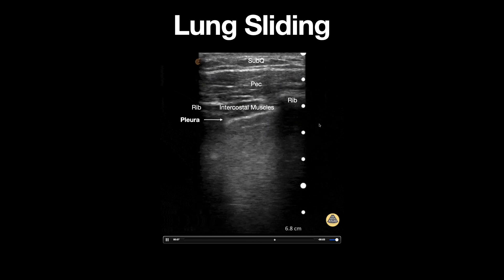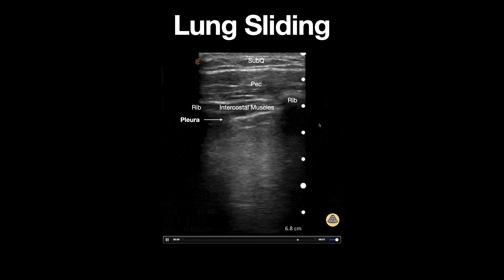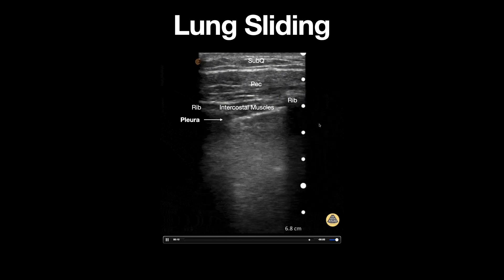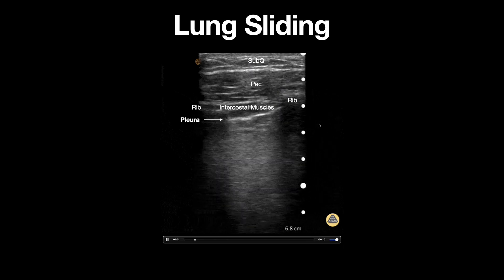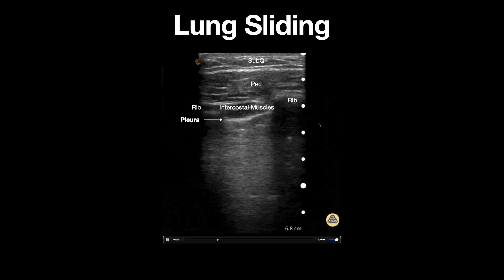The presence of lung sliding rules out a pneumothorax. Remember that this only applies to the area of the lung that you're evaluating under ultrasound.